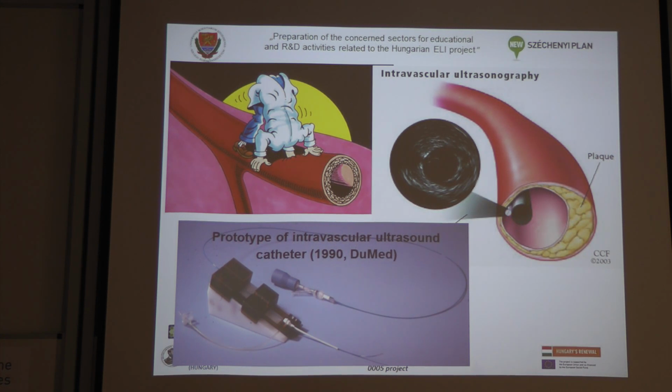And of course we can realize that the major breakthrough is that in the early 90s they were successful to miniaturize this intravascular probe. Before the 90s, they used to be large transducers like this fist or something. And the coronary arteries, in which we are interested, could be as small as 2 millimeters inside, or maybe even less.